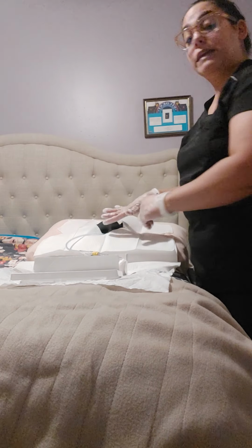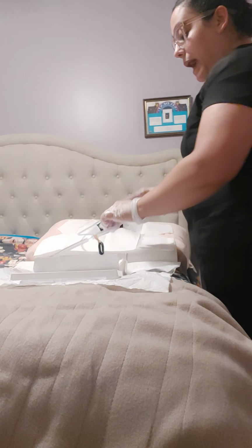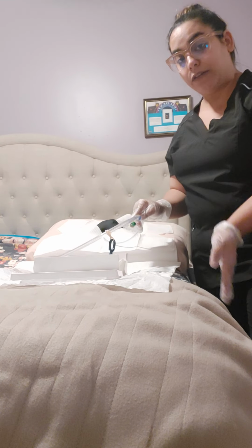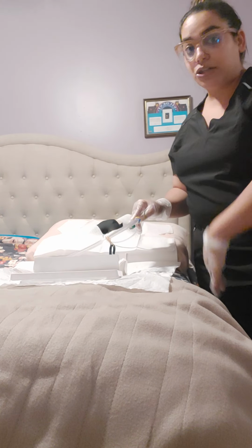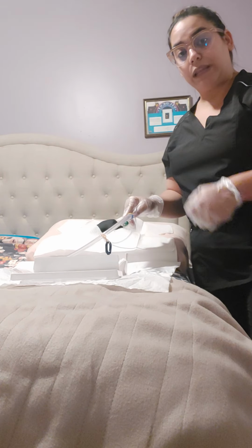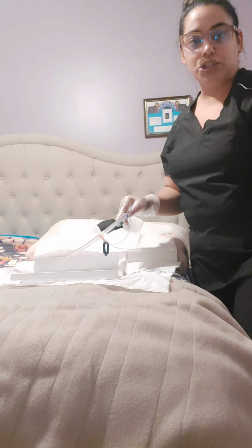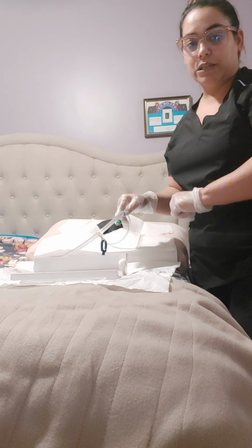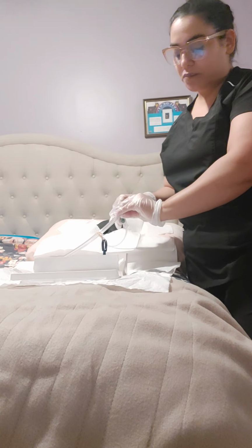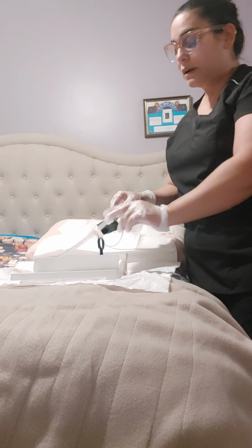Now, once it is in my patient, I would make sure that I tape the actual tubing to the inside of the thigh of my patient, not underneath, not anywhere where the tubing can go underneath their leg, just because when patients move, they can tug on the catheter and actually do some damage to their sphincter and pull out the catheter.